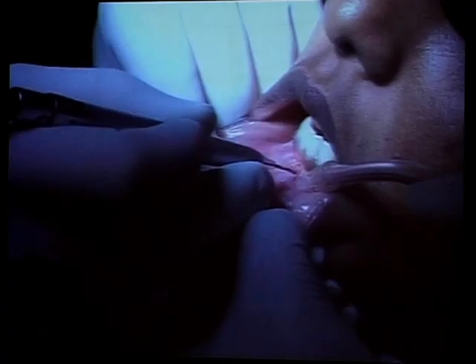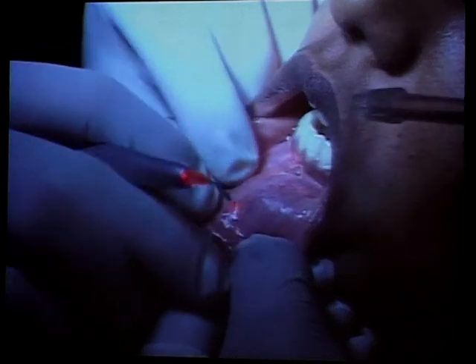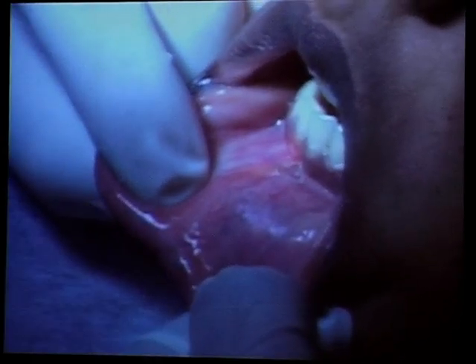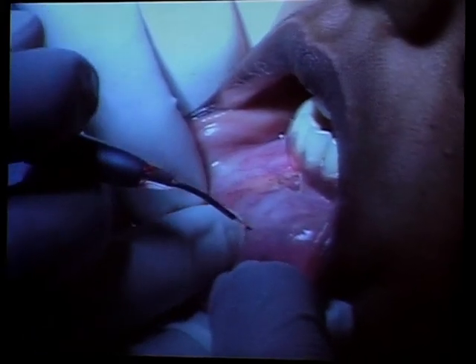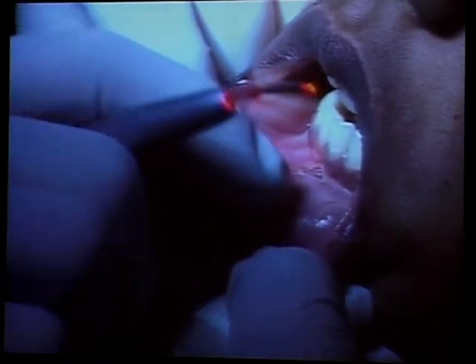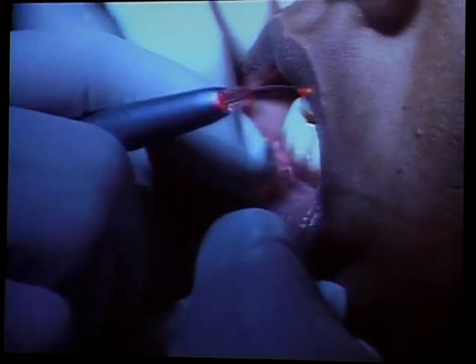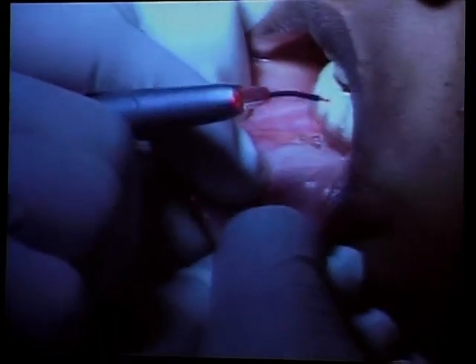Can we go up close a little bit, please? We need them to appreciate that there is no carbonization while you're doing this, Ralf. This is beautifully done, and you see the tissues are only white and brown, and there's nothing that looks like black over there. Yeah. And then you just have to control this, if there are still fibers left, but in this way it's okay.